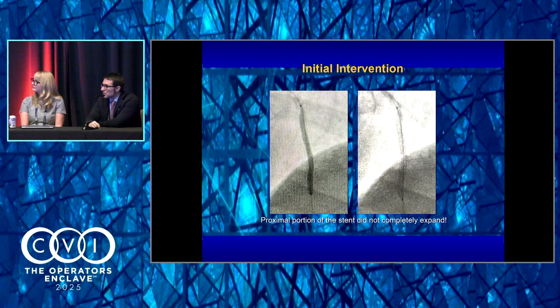Yeah. Sure, Alison, what would you do at this point? So you put a stent in, there's a dent. We want to understand the distribution of the calcification in this case. I think if I had just deployed a fresh stent like this and noticed that there was underexpansion of a portion of the stent, obviously the imaging will hopefully help you understand what's going on, but I would actually likely use an OPN balloon, potentially something like shockwave, or even just a scoring balloon, depending on exactly what I'm seeing on the intracoronary imaging.